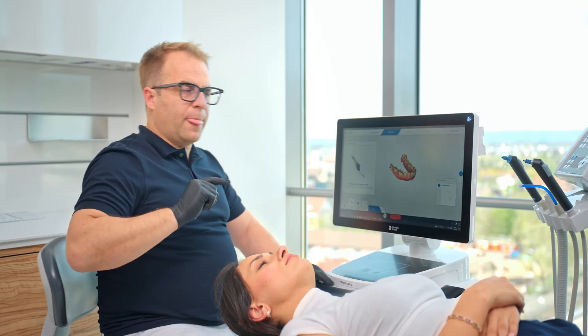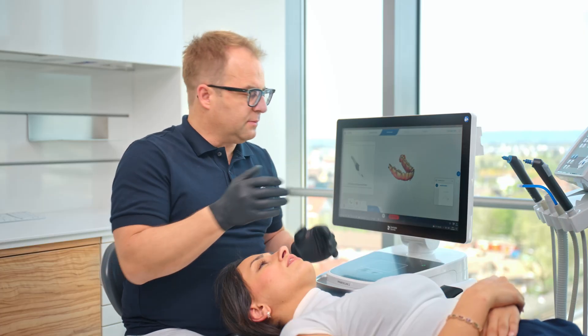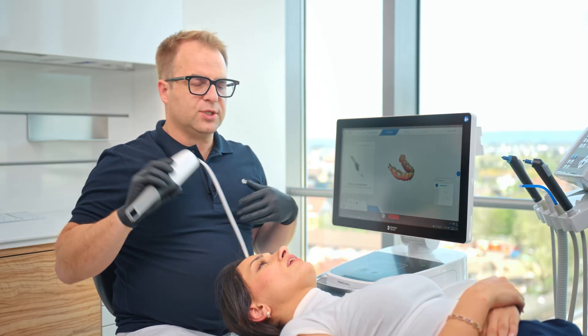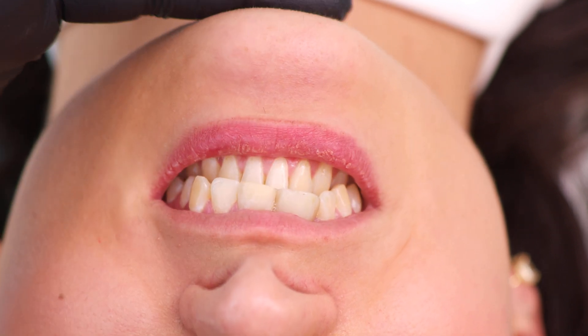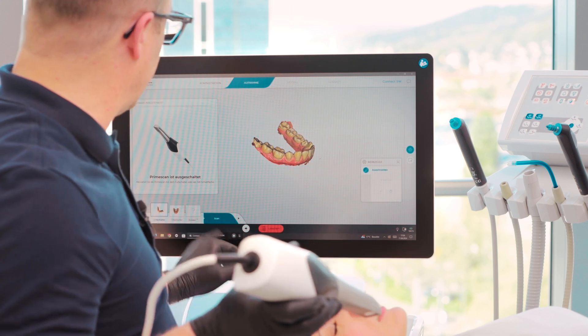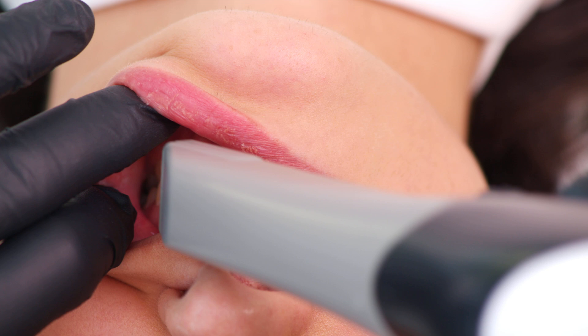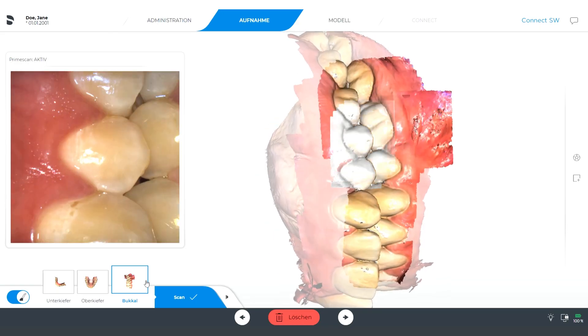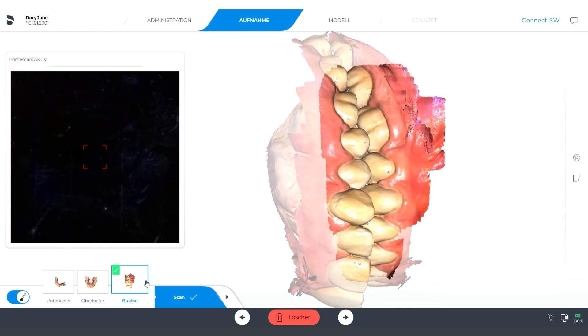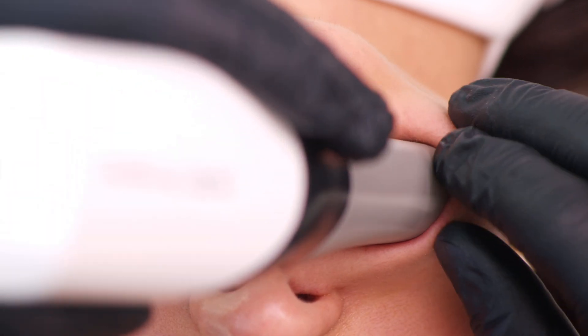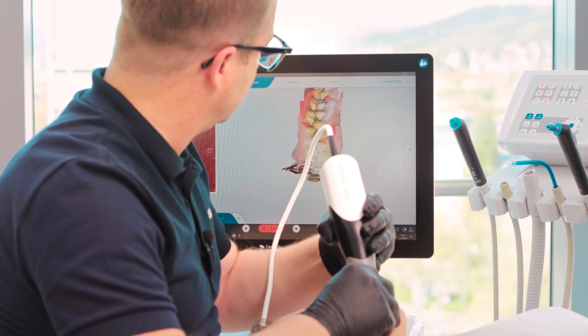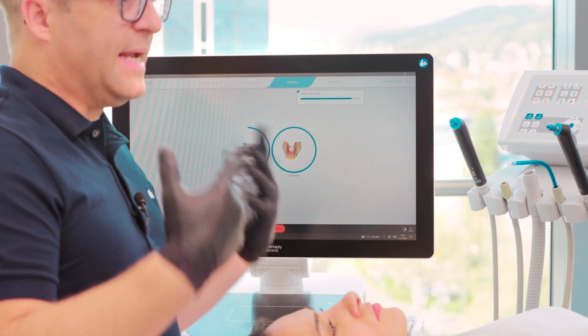That was the lower jaw. Now there is still something missing — we need to align both upper and lower jaws in the right occlusal position. This is done by a buccal scan. You can close your mouth, find your occlusion, make tuck-tuck-tuck and keep this position please. I will now activate the buccal scan — just one scan on the left side, move it a bit upwards and downwards, then on the right side, and that's it.